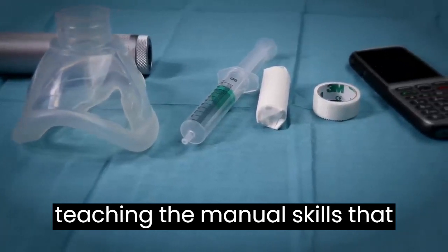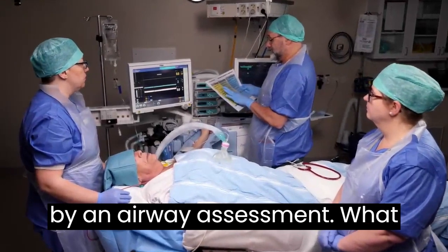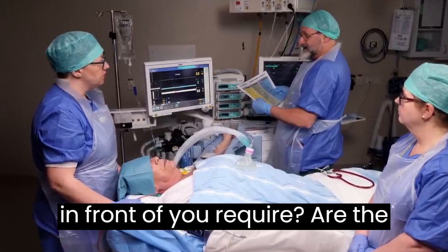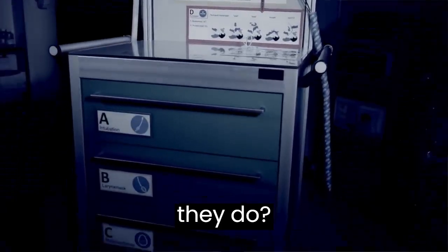the manual skills. Your intubation should always be preceded by an airway assessment. What equipment and personnel does the patient in front of you require? Are there complications you suspect may arise, and is everyone on board with the plan if they do?